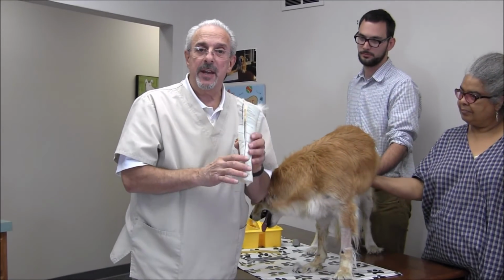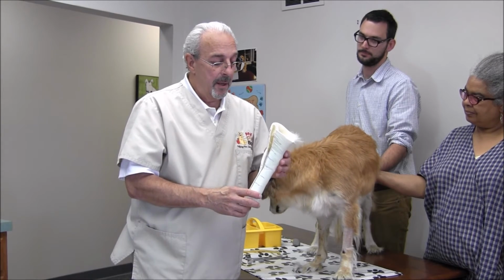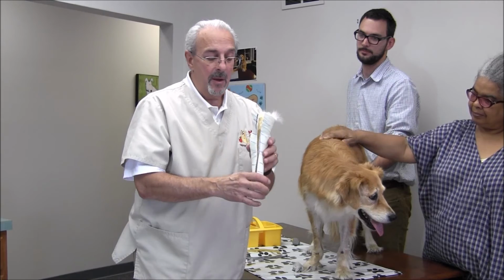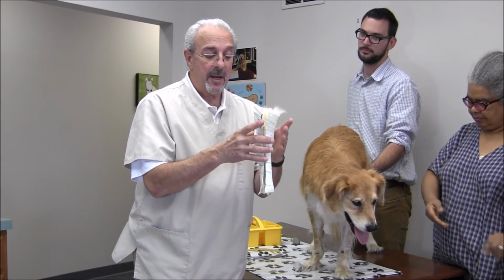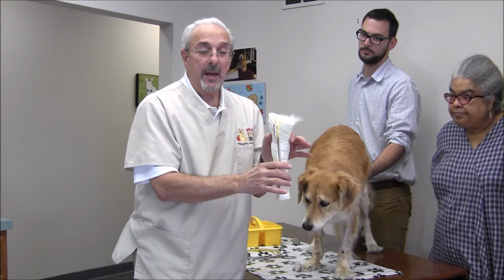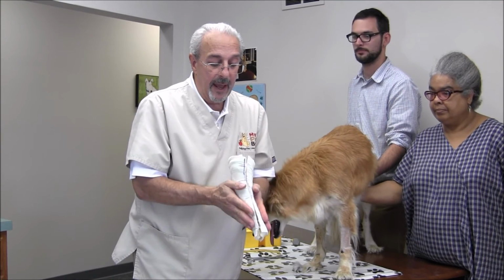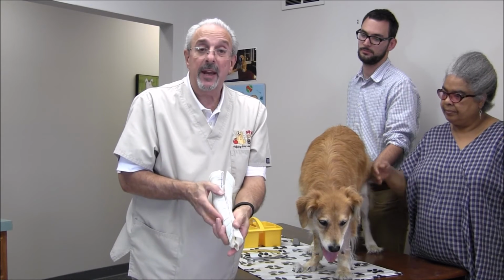So that's how easy it is to take a cast for an elbow brace. The important thing is, get as high as you can up into the axilla. Only wrap about 3 layers. Wrap from the axilla down to the carpus. Come in above the humeral condyles for suspension, and flatten out mediolaterally on the radius and the ulna.